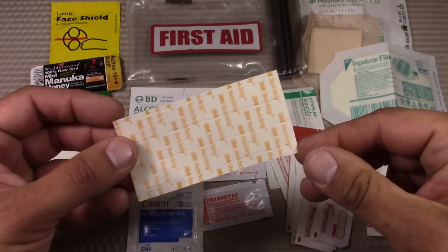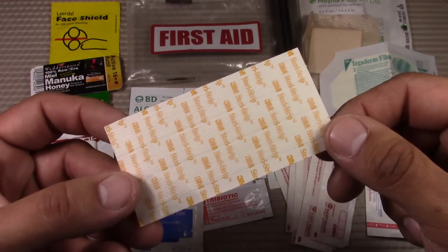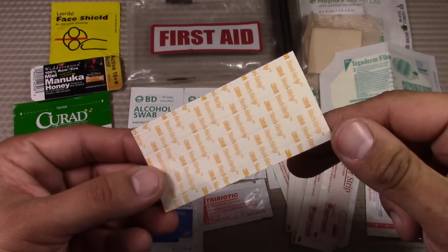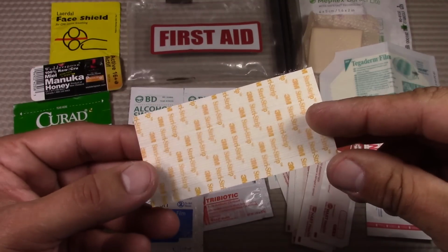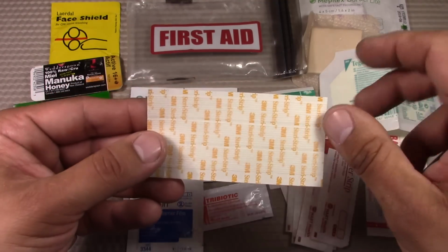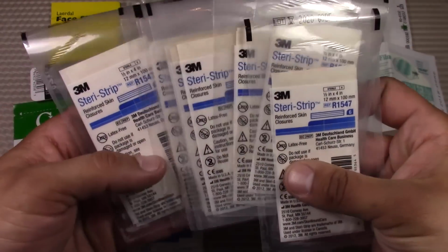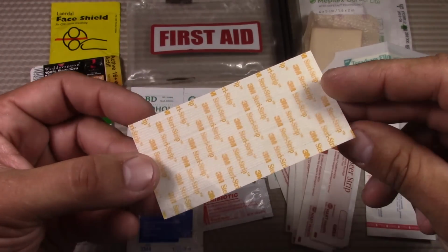The first item is a single sheet of 3M Steri-Strip reinforced skin closures. So these are designed if you have a cut, for example, a large cut, and in a replacement of sutures or staples or anything like that. Basically, you're going to be putting these Steri-Strips over the wound, and it's very good for less trauma, and it has better cosmetic results at the end. So a single sheet of Steri-Strip.